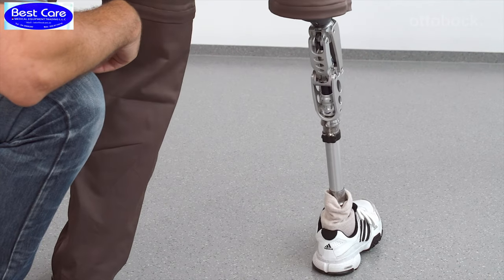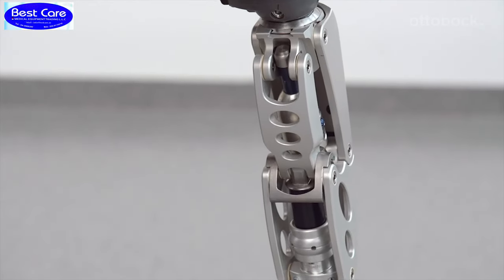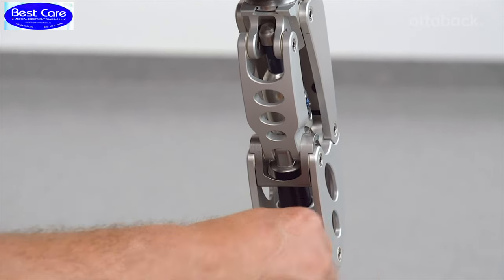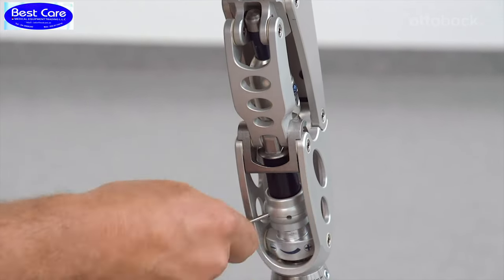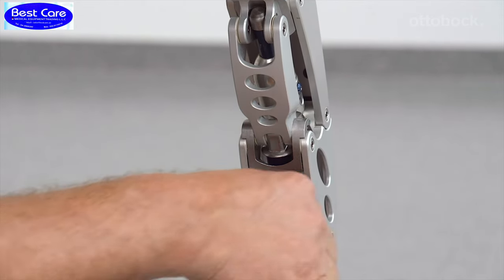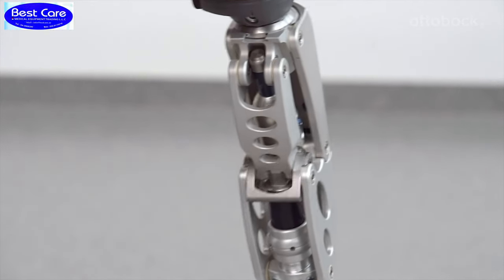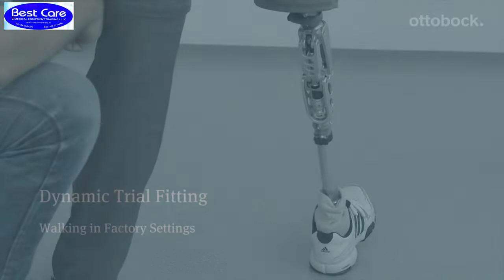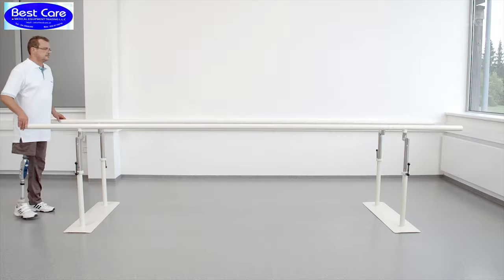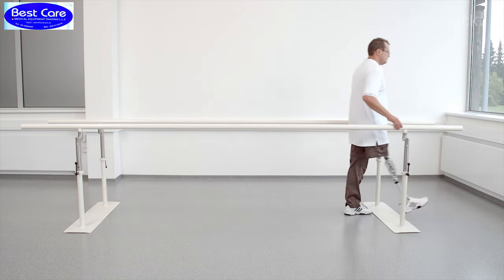At stance phase flexion, the blue rubber bumper is compressed, causing the pivoting mount to move up and generate resistance. The pivoting mount serves as a visual control for measuring the efficiency of the EBS unit. The hydraulic component of the EBS unit dampens the subsequent stance phase extension. To get a first impression of the knee, let the user walk in the parallel bars with the factory setting.